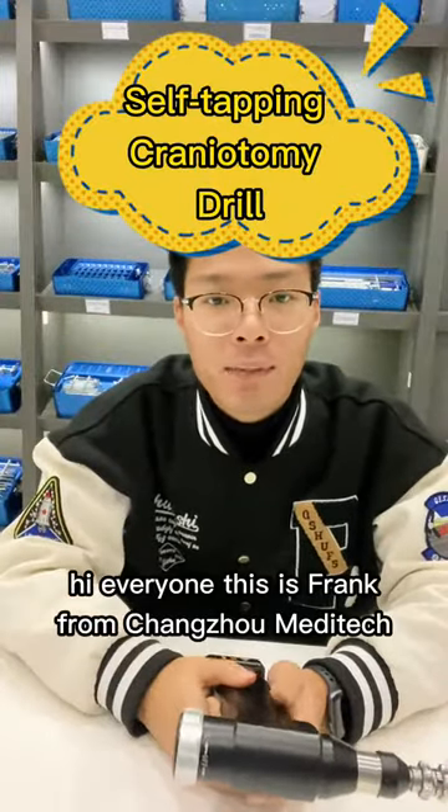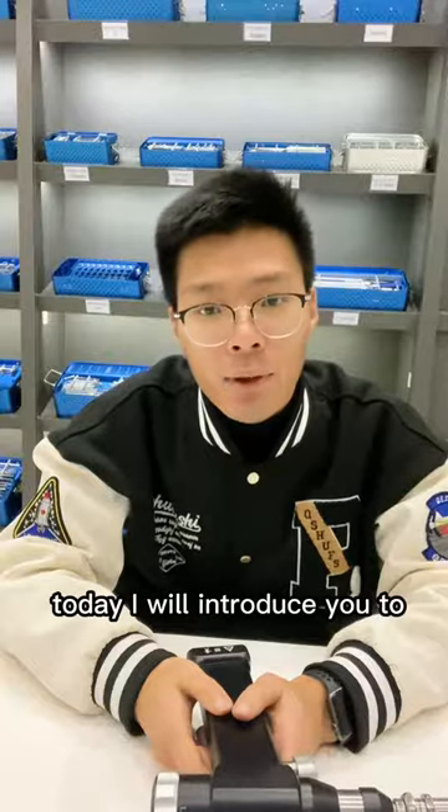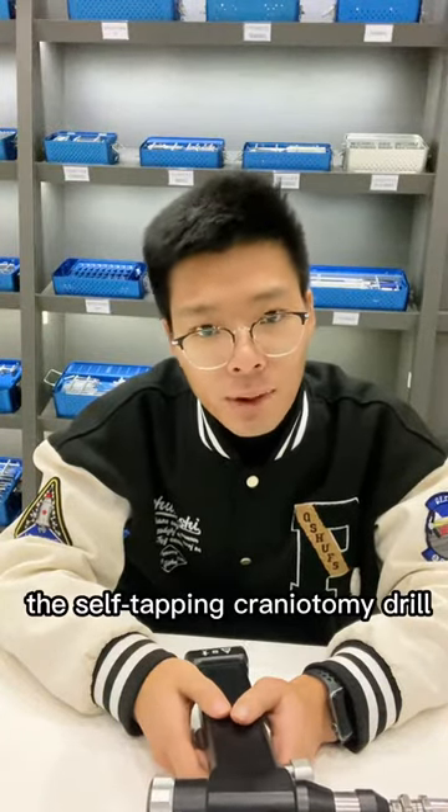Hi everyone, this is Frank from Changzhou Meditech. Nice to see you today, and today I will introduce you to the self-tapping craniotomy drill.